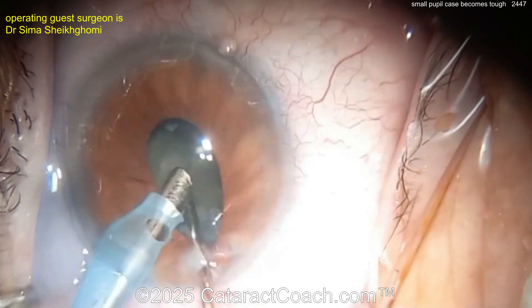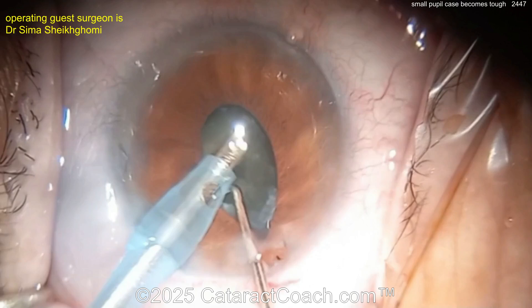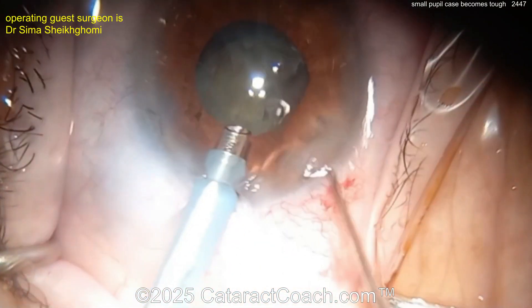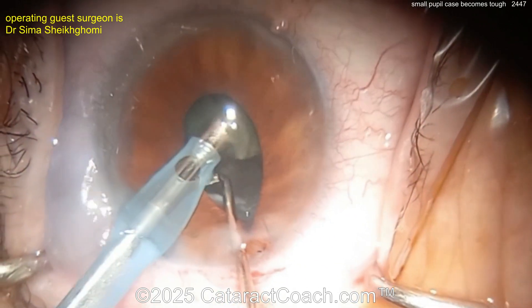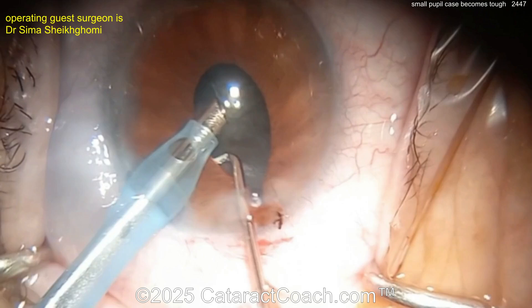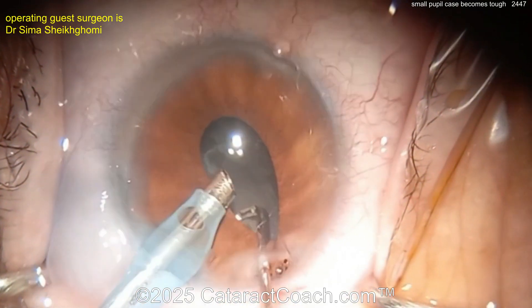My encouragement to you: use a special side port blade — an MVR-type blade, a 15-degree blade, or some smaller-sized blade to make the paracenteses. Otherwise they leak too much. Look at that chopper through the paracentesis — there's a ton of iris prolapse. The paracentesis is just way too big.